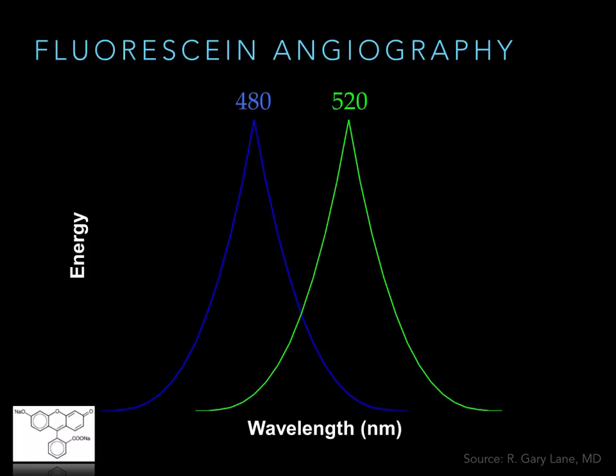In general, we all understand this idea of fluorescence. A photon of light hits something, an atom, the electron gets excited. The whole molecule or the atom is excited. The electron goes up to a higher orbit, and when it descends down into its normal orbit, it gives off a photon of light that happens to be of a different wavelength. That's called fluorescence. Fluorescein, sodium fluorescein, does that.